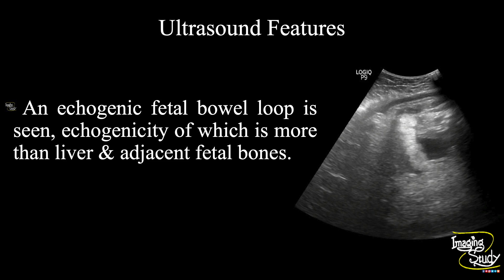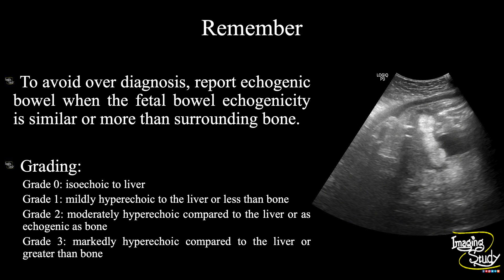What I have told here may not be satisfactory for beginners, so let's check the take-home message in more detail. To avoid over-diagnosis, report echogenic bowel when the fetal bowel echogenicity is similar to or more than the surrounding bone. Sometimes it may be confusing, so this comparison may help you avoid over-diagnosis. A sonographic grading system exists for echogenic bowel to assess the degree of echogenicity, although this is not commonly used in clinical practice.